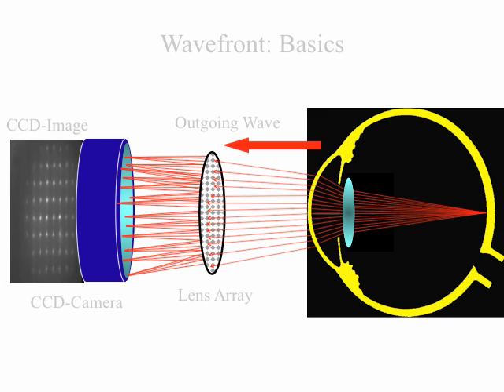We're going to illuminate the retina, and the rays of light are going to come out of the eye. And if it were an emmetropic, absolutely perfect eye, the rays of light would all come out absolutely parallel. But I represent to you that because of distortions, aberrations in this wavefront, the photons are not all going to be parallel. Some of them are going to be a little bit diverging, some are going to be a little bit converging. But for a second, let's picture the perfect eye, where the rays of light are coming out of the cornea absolutely perfectly parallel.